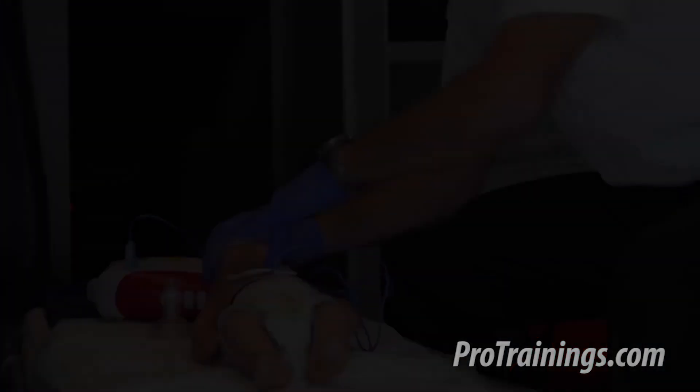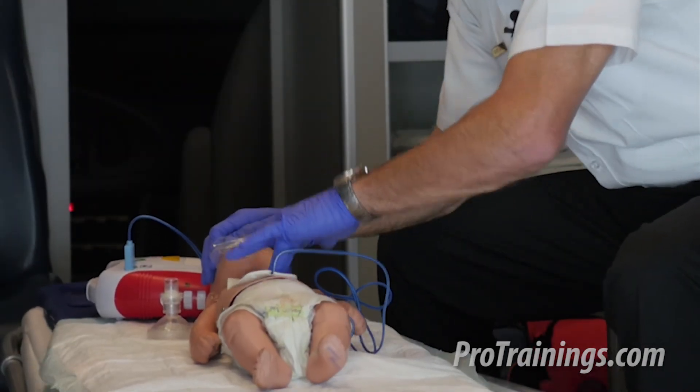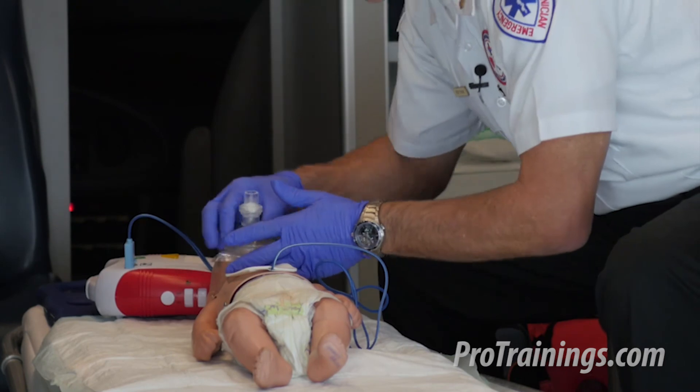Continuing compressions: 8, 9, 10 ... 26, 27, 28, 29, 30, followed by two more rescue breaths.